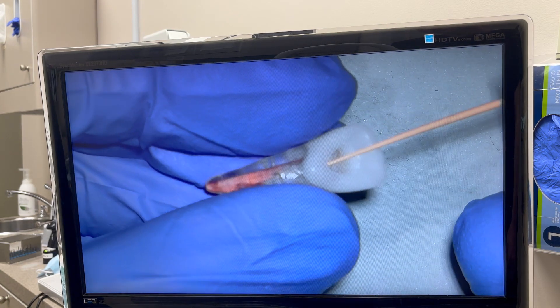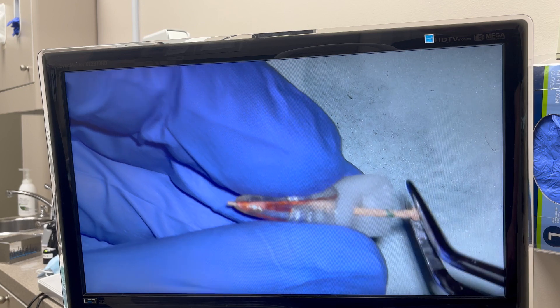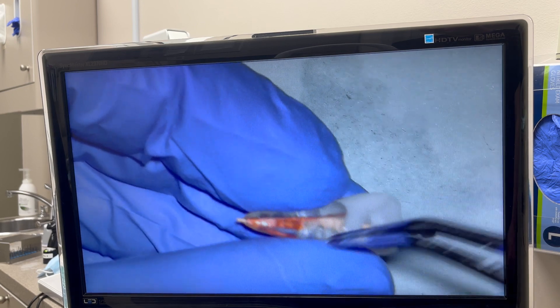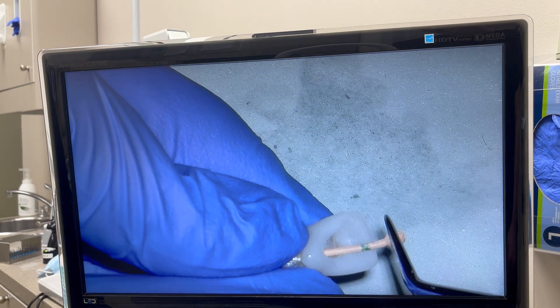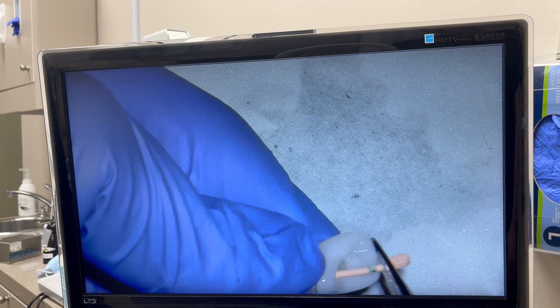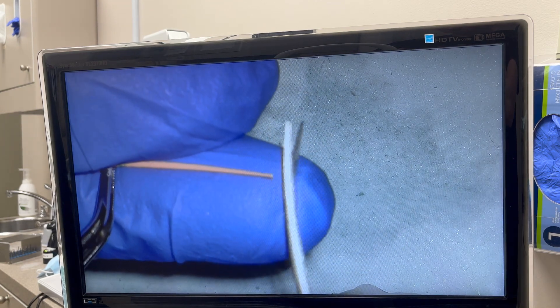It's 2 millimeters outside the apex. So if you pre-measured it to 24 and just put it in and push it, it'll stick out. Push it all the way in — obviously you're not going to see this part in the exam — grab it at your reference point, then measure. Your working length is 24, but you have 26 or 25.5, so you have about a millimeter to a millimeter and a half outside the apex. Just grab scissors or a sharp blade and carefully remove and re-measure.